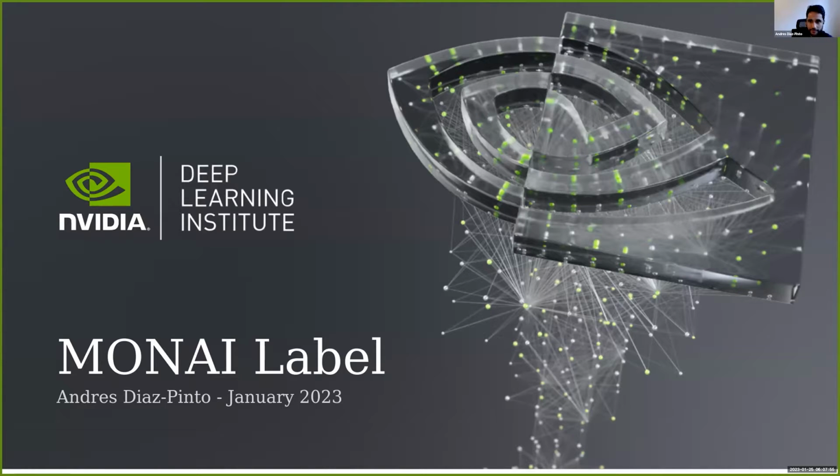Yeah, hello everyone. I'm Andres Diaz-Pinto. I'm a technical marketing engineer at NVIDIA. I'm going to split this presentation into two parts. So first, what are the new things about MONAI Label, and for those that don't know what MONAI Label is, I'm going to explain a bit what it is and also the different use cases. So that will be for the second part.